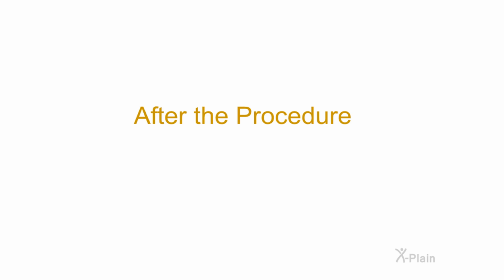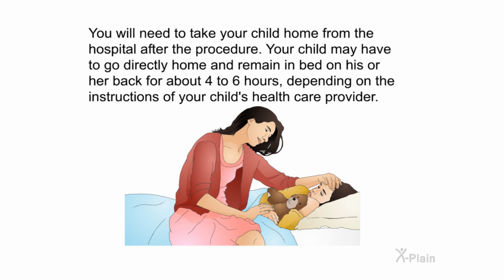After the procedure. You will need to take your child home from the hospital after the procedure. Your child may have to go directly home and remain in bed on his or her back for about 4 to 6 hours, depending on the instructions of your child's healthcare provider.